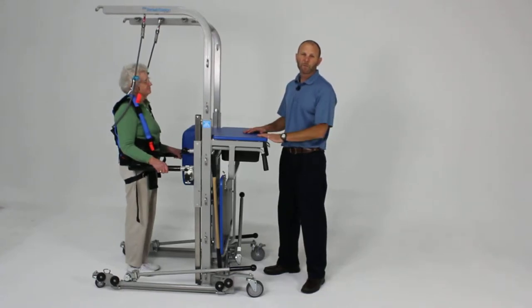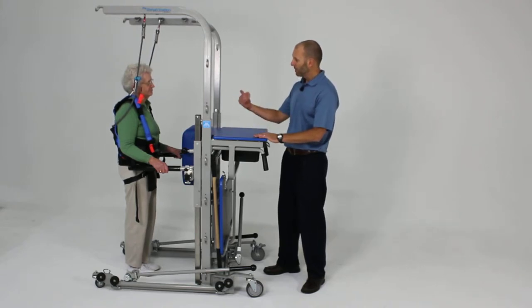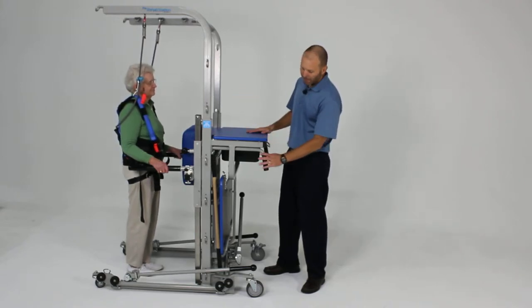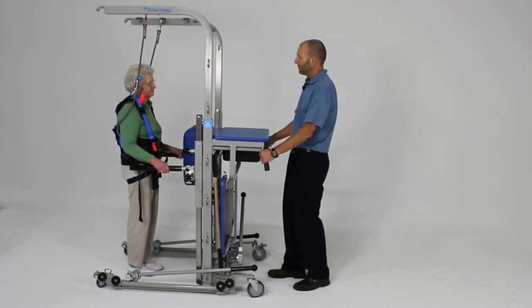While not designed primarily for doing overground walking, the rehabilitation device can be used in certain cases and in certain environments to do a little bit of that. So we'll show you how you can do that. The patient will be facing the therapist, and the therapist can grab a hold of the handles here and guide the patient in their walk.